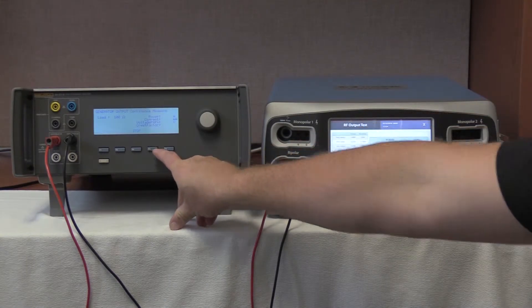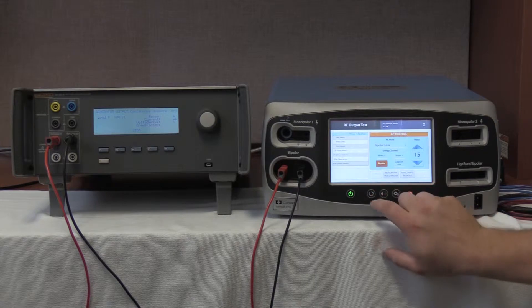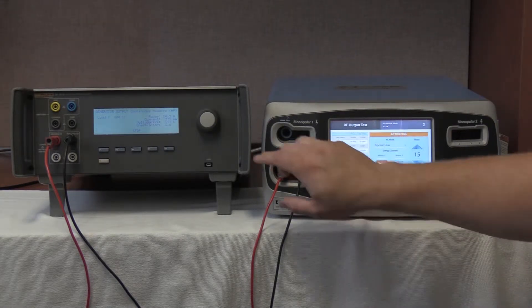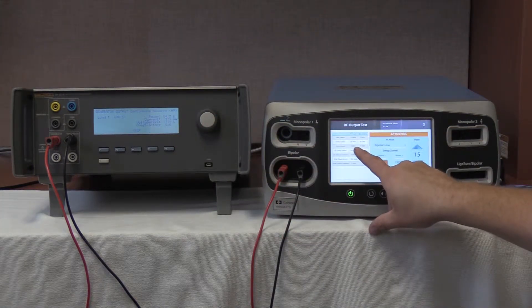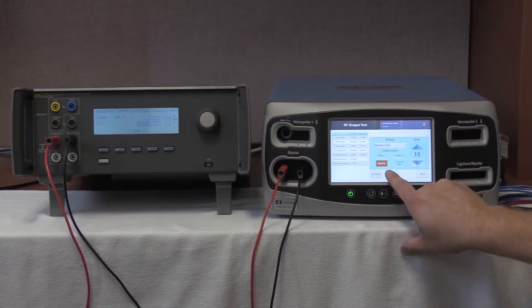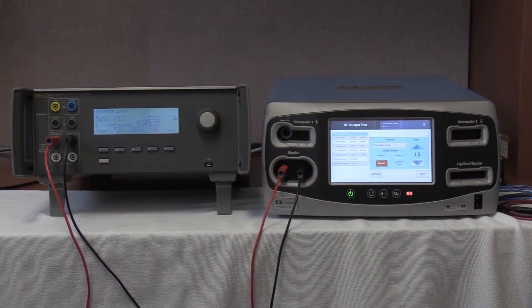Start continuous on the QES3 and activate on the Valleylab Covidien FT10. Our range is 335 to 450 milliamps. We are reading 379 milliamps on the QES3 with an output of 383.7 milliamps on the FT10, all within range. We are going to press deactivate, hold values, and stop on the QES3. That completes the bipolar energy output testing at 100 ohms on the Valleylab Covidien FT10.